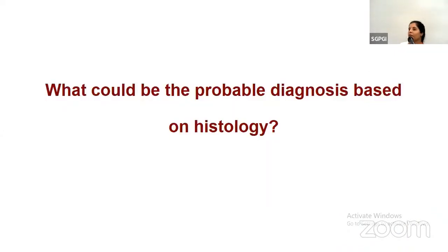So I would request you to please give your opinion based on the histomorphological features. What do you think would be the probable diagnosis or the differential diagnosis in this case? Anyone?